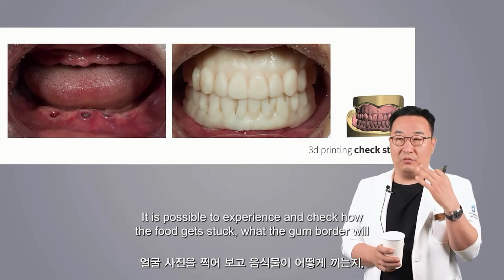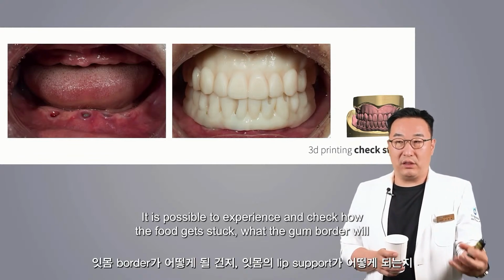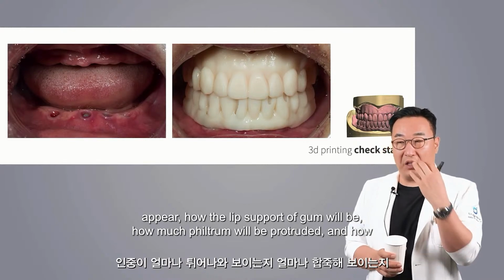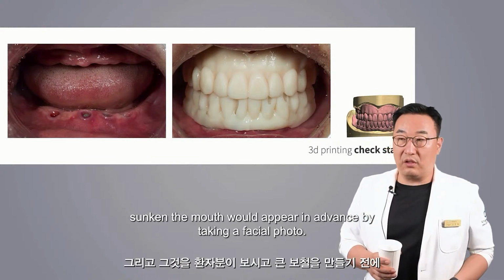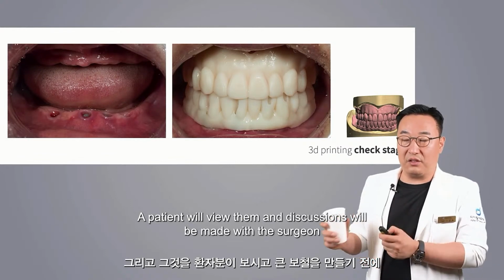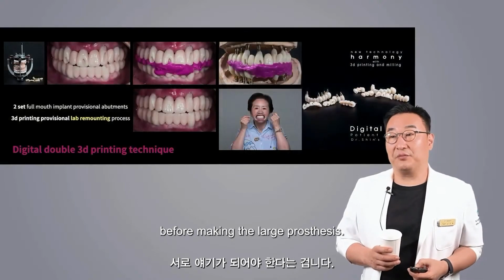It is possible to experience and check how the food gets stuck, what the gum border will appear, how the lip support of gum will be, how much philtrum will be protruded, and how sunken the mouth would appear in advance by taking a facial photo. A patient will view them, and discussions will be made with the surgeon before making the large prosthesis.